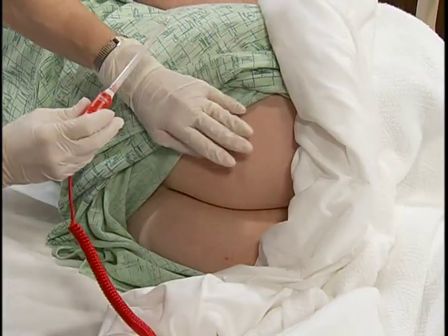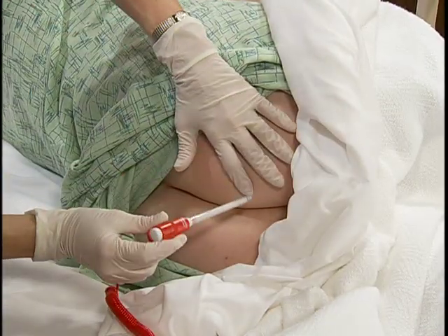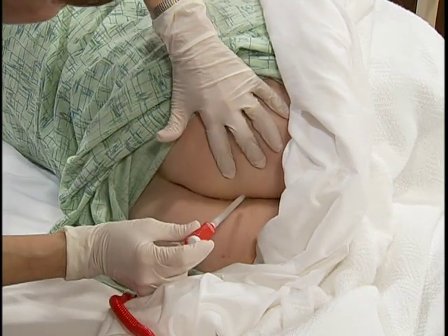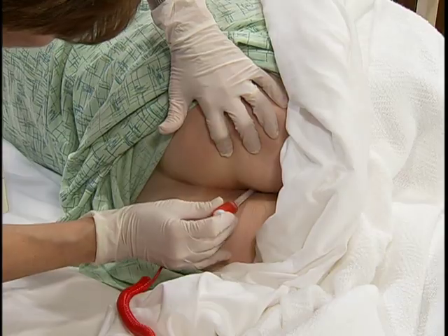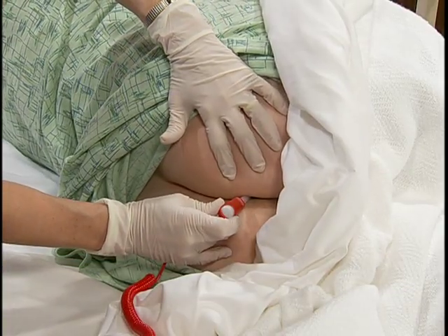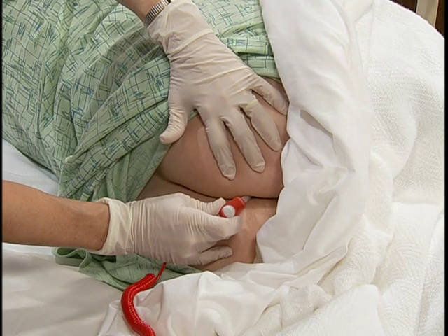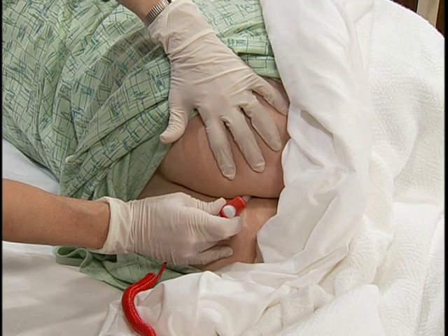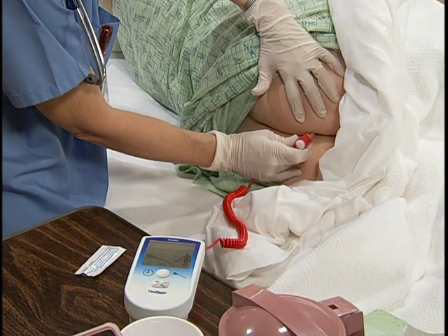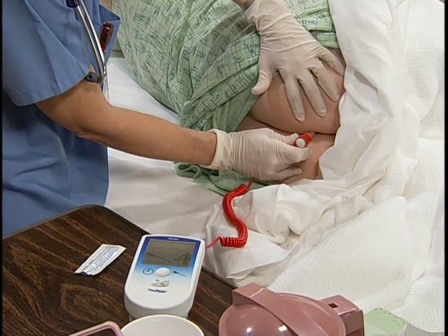I need you to breathe slowly and try and relax. With your non-dominant hand, separate the patient's buttocks to expose her anus. Instruct her to relax and breathe slowly. With your dominant hand, gently insert the probe one and a half inches into her anus in the direction of the umbilicus. Do not force the probe. Hold the probe in place. When the completion signal sounds and the digital display shows the patient's temperature, remove the probe.